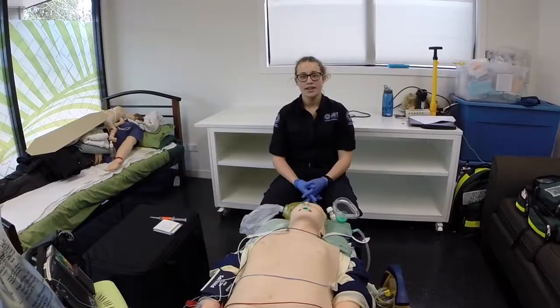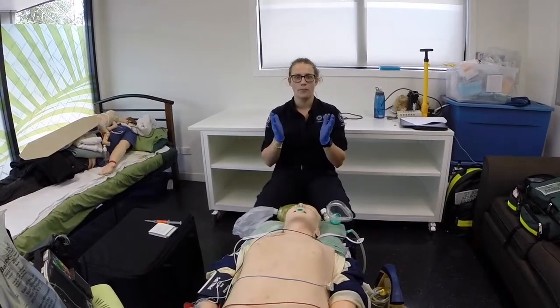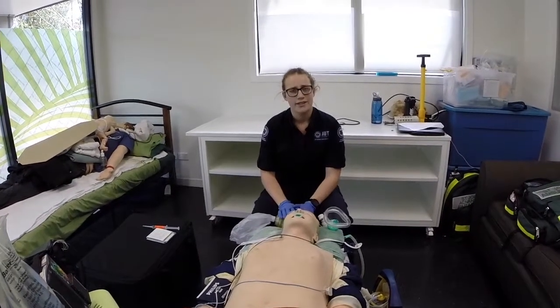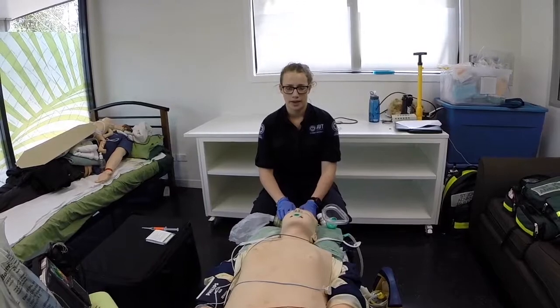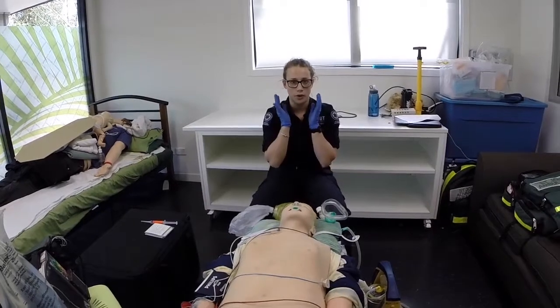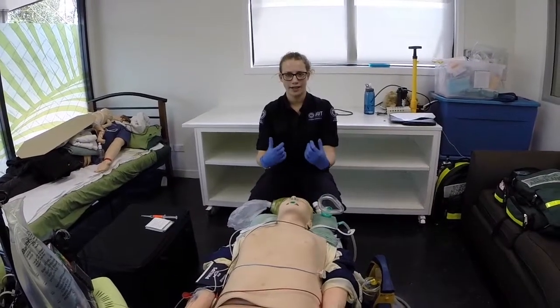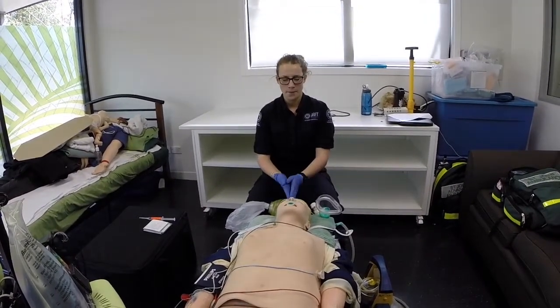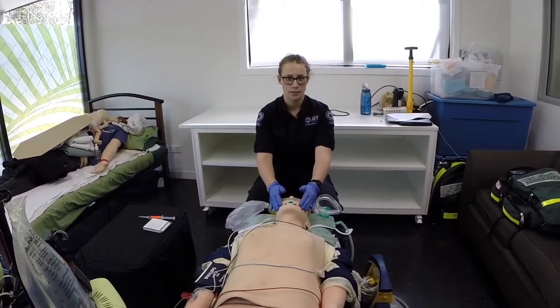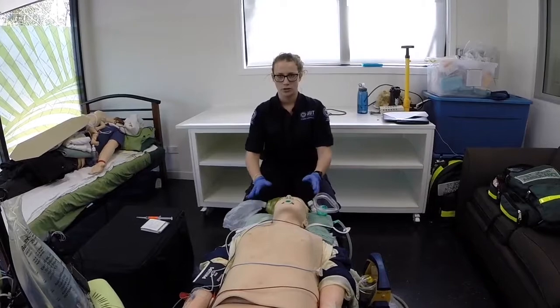Cool, thank you. So we are now in the back of the ambulance where it's a controlled environment, and we've got much better lighting for the RSI officer when he arrives. So before RSI, we need to manage this TBI of this patient. So we've removed the hard collar and we've placed a soft collar by placing 2 towels rolled up on either side of the patient's head. We've also put the patient into the sniffing position by rolling up a towel and placing it underneath the patient's head. We're maintaining an airway at this moment with an OPA which has been currently tolerated by this patient, and we've also got supplementary oxygen flowing through nasal prongs for this patient.